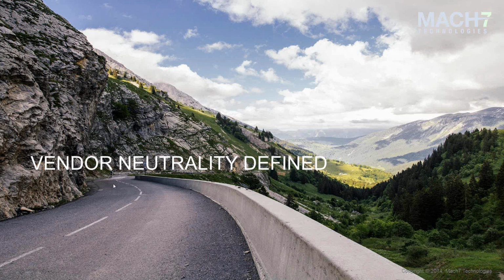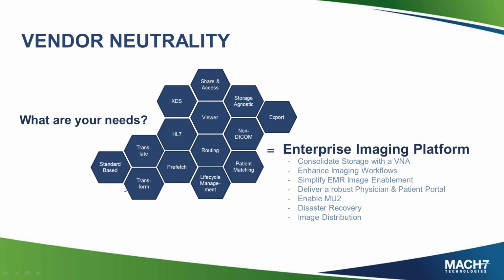Okay. So let's talk about what vendor neutrality is a little bit. I'm going to take a minute to go through some of these and highlight some of the features around these different areas. When you look for vendor neutrality, number one, it needs to be standards-based, whether that be DICOM and ensuring that the DICOM coming in is standard.